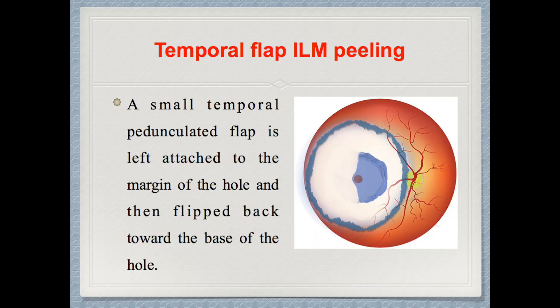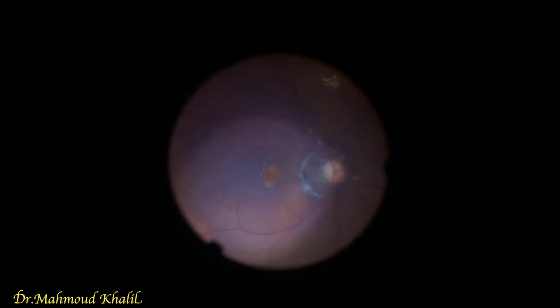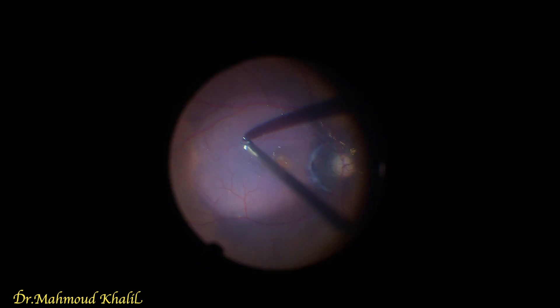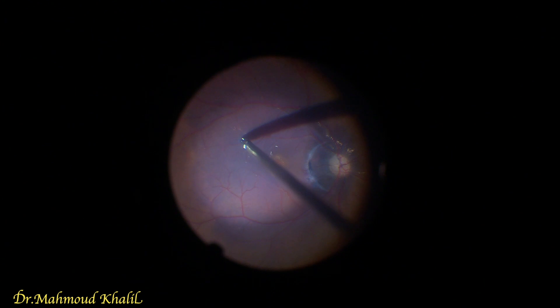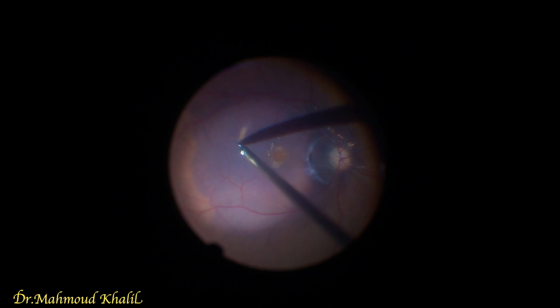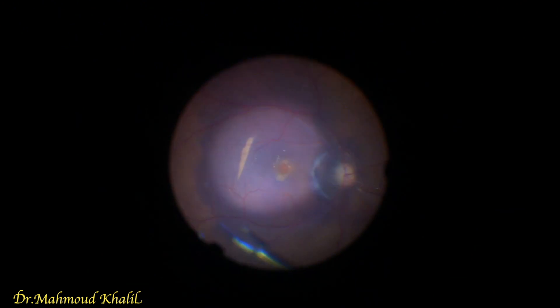The second technique is the temporal flap ILM peeling. In this technique, a small temporal pedunculated flap is left attached to the margin of the hole and then flapped back towards the base of the hole. We just peel the ILM at the temporal site and not all around. As seen in this video, this patient has a traumatic macular hole with choroidal rupture at the edge of the optic disc, starting to make a slice at the temporal part of the macula as the base for the temporal flap.